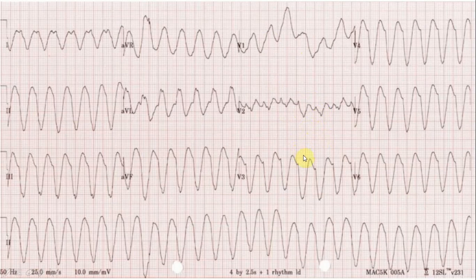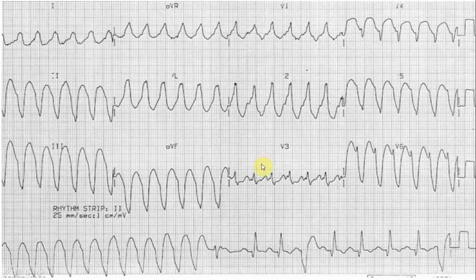Looking at the conventional criteria for the same patient: in lead I the axis is negative and in AVF it is also negative — that is a northwest axis, very characteristic of VT. In lead III there is a notch on the down-sloping part of the QRS complex — the Josephson sign — and similarly in lead II and AVF. These are all characteristic features of VT.